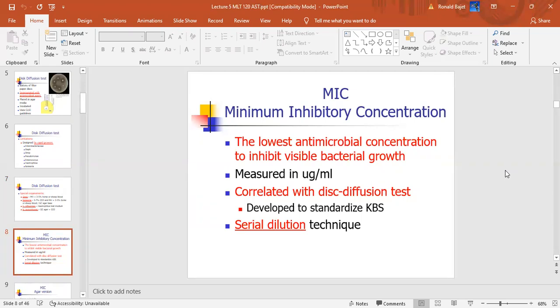So you're not going to be doing the tube method, but based on the different methodologies, MIC, like I said, is done with the tube method. Rather than doing tubes, you have these wells. It's a square plate with wells in it, and the company will actually do the dilution of antibiotic in these wells. But so that you understand what's going on, we'll do tubes.